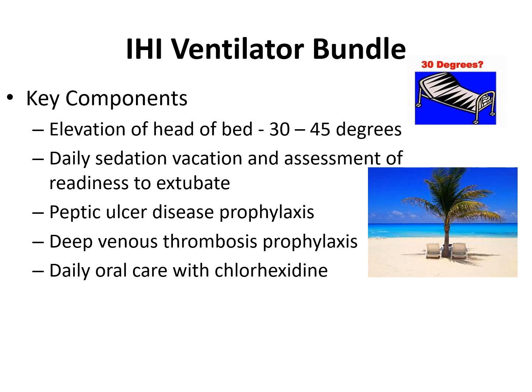Then there's the daily sedation vacation, and this means that you're assessing daily the patient's readiness to be extubated. So you need to lighten up on the sedation. You should have a hospital protocol for specific guidelines like this, and you want to coordinate with the respiratory therapist for spontaneous breathing trials. This should be done daily, unless your patient's severely hemodynamically unstable. But every day the patient's on a ventilator is every day we're trying to get them off a ventilator. As soon as you intubate somebody, the goal is to get them extubated.